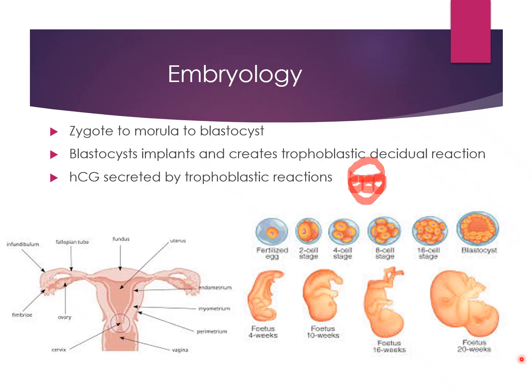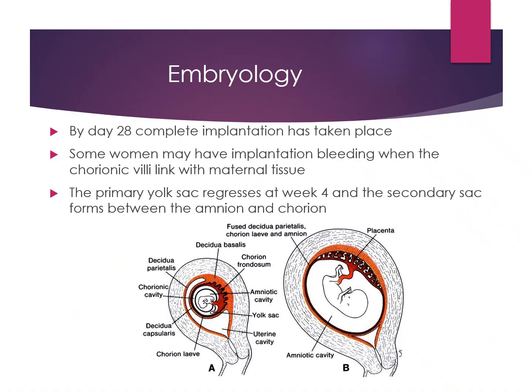So moving on, we are going to take a look at what we do when they come for their first ultrasound. So they found out they were pregnant at about 4 weeks. We can already see that outlining of a spine. How do we date where they are at? And that's what we're going to learn about in measurements. And in order to know where we are in our dating and to make sense of the dating with our measurements, we need to know what we expect to see.